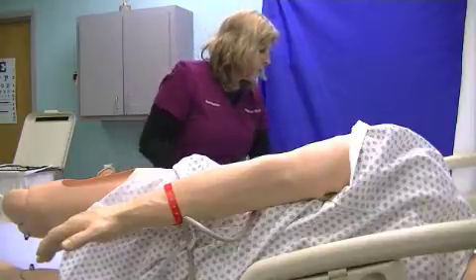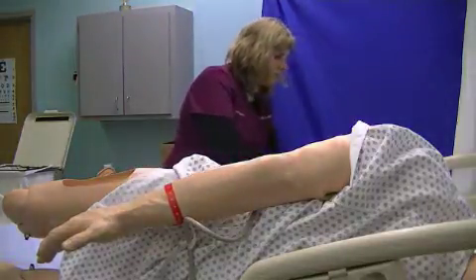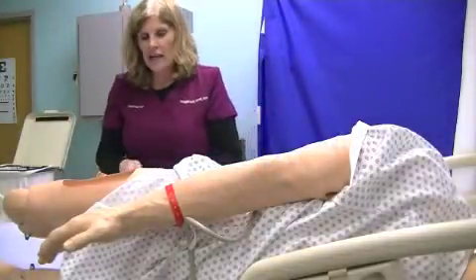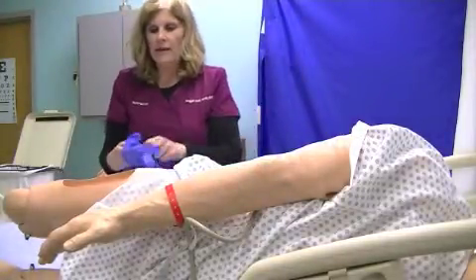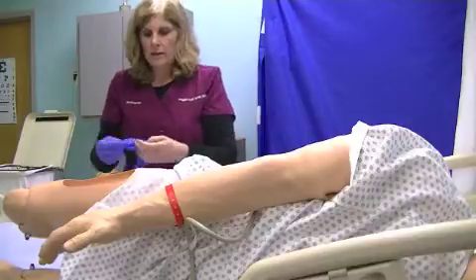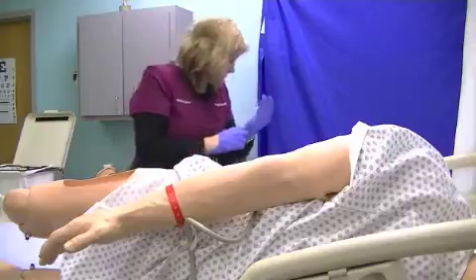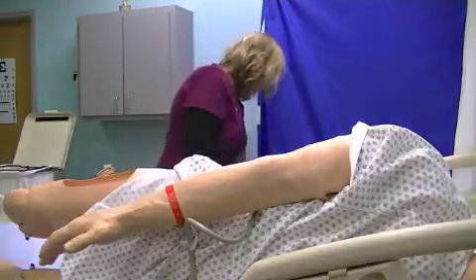I'm going to make sure I put a pair of gloves on too. Now again, I'm going to assess the area, so if they have any rectal bleeding, any hemorrhoids, and anything like that, I'm not going to take the temperature. So I'm going to put my gloves on, because I don't want to transmit the bacteria.